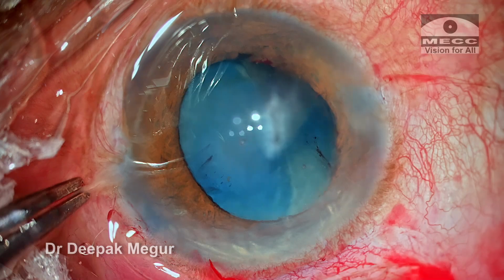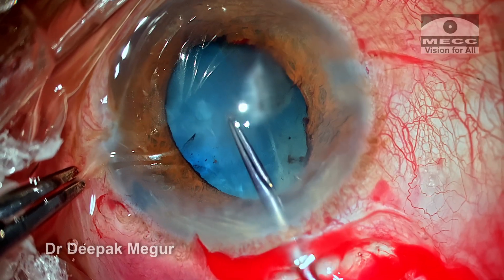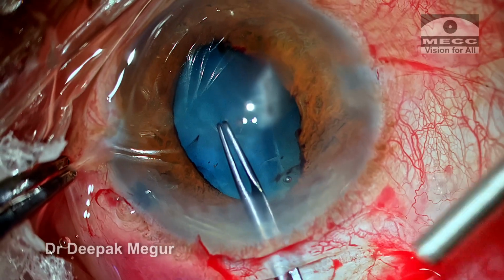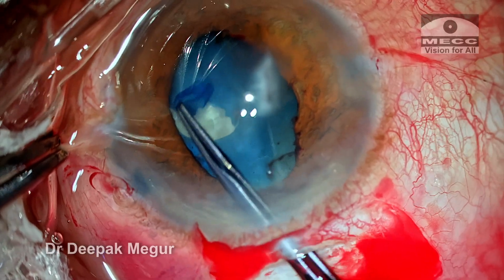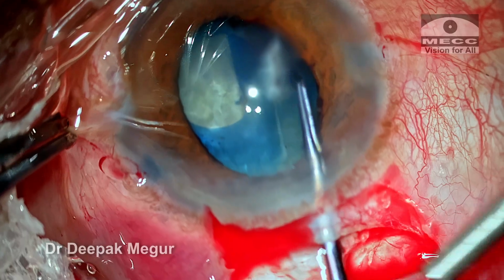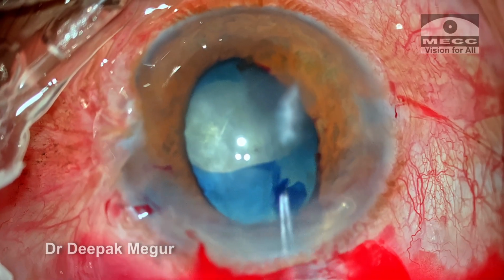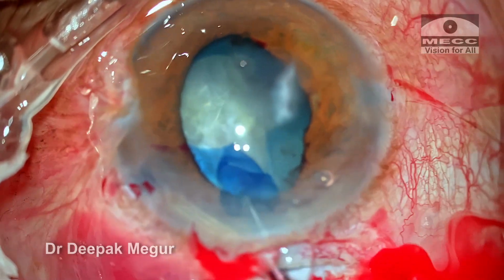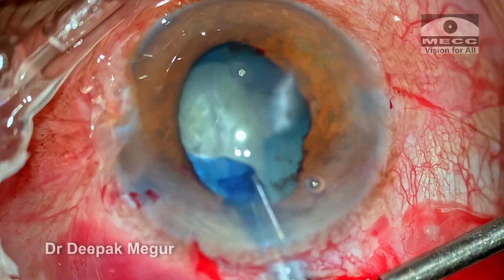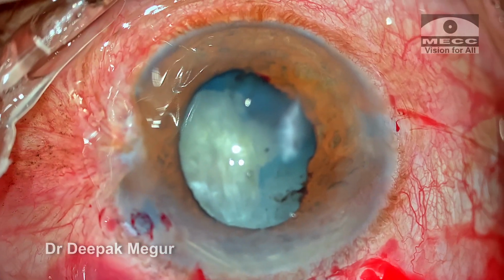So the basic idea is I would want to avoid the area on my right side to initiate the rhexis, because I know that the capsule is already compromised there. So I'd like to begin the rhexis from my left side, make a puncture, raise a flap, and then try to create a sort of circular opening at least on my left side, because in the worst case scenario I would like to still have some support of the capsule to place a posterior chamber lens. But as soon as I reach the area of trauma, the anterior capsule is quite thickened there and it's uncontrolled, so I couldn't go around it. So I ended up having a slightly smaller opening on the right hand side.